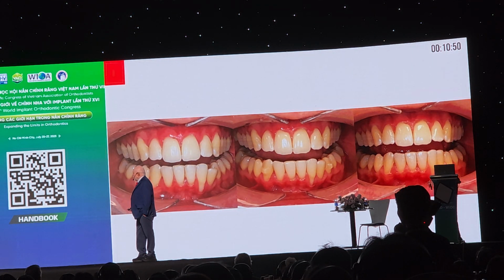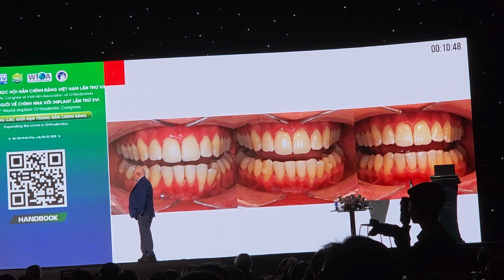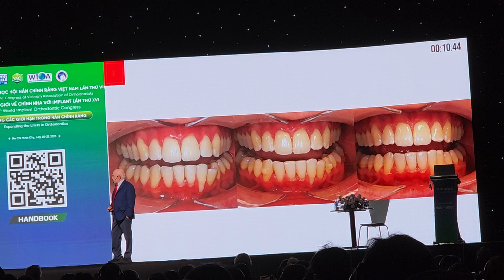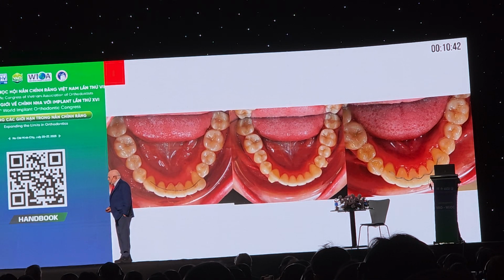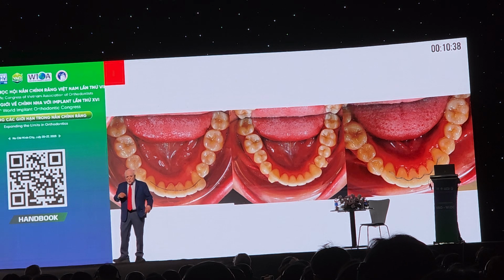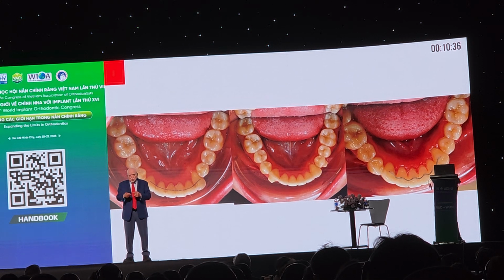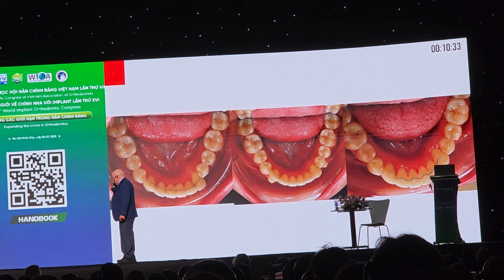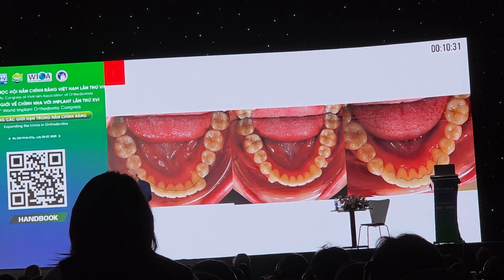And now the patient is ready to go to a periodontist. They can go in and do a gingival graft, and this was published in GCO. So these days, I usually recommend these braided wires on a spool for 3 to 3 retainers in patients. These wires are not really active.